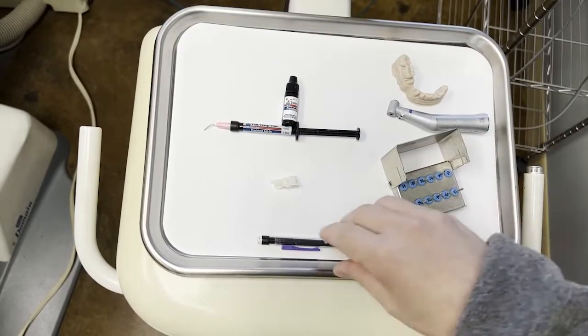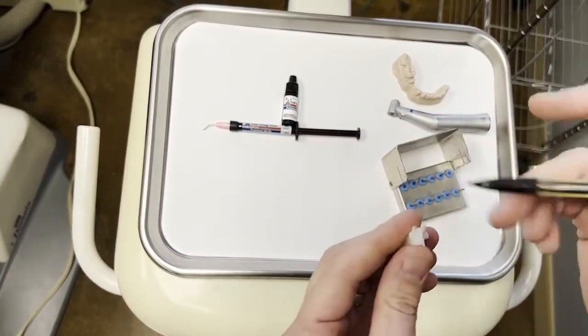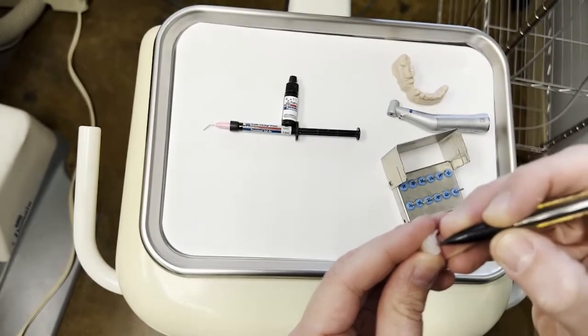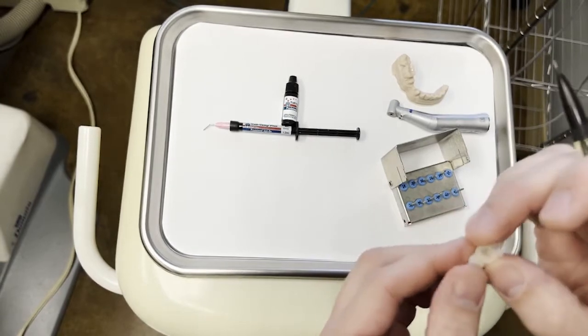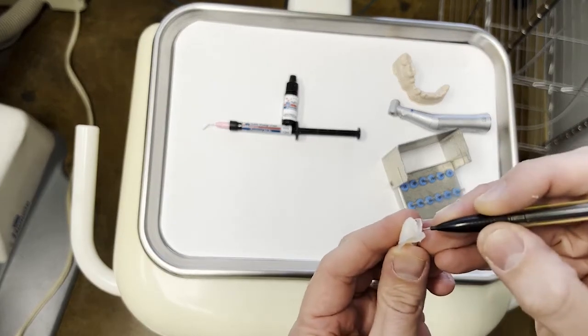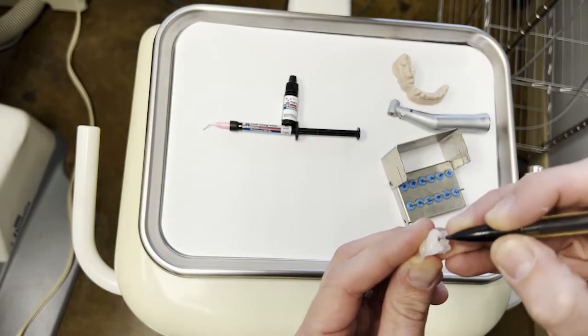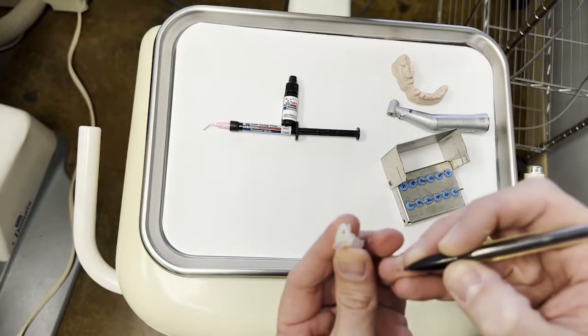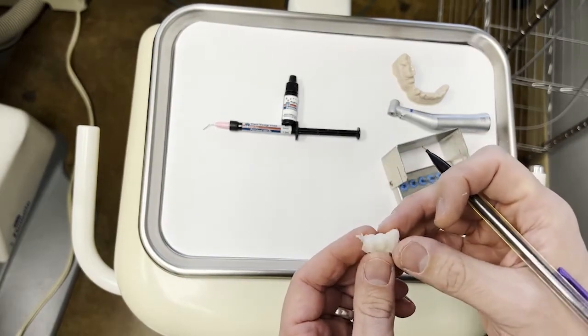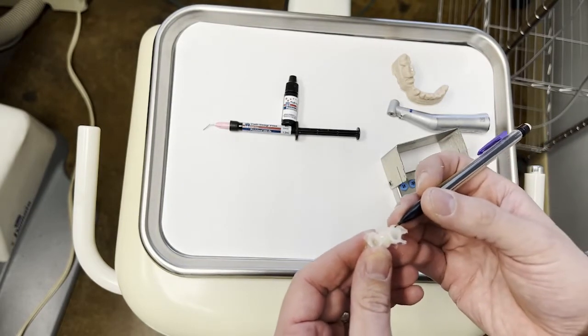Now that we have our provisional made, it's time to trim it. And one thing that I do always on multi-unit restorations, and even a lot of times on single unit restorations, is I will go in and take a pencil and mark the interproximal contacts. You can kind of see that on this material you get a real glossy finish right there where it touched the tooth in front. So I'm going to mark that to make sure that when I'm trimming this, I leave that pencil mark behind. If I leave that pencil mark behind while I'm trimming this, I know that I'll have interproximal contact on my provisional. So now the first thing I have to do is just start getting all of this flash out of the way. And this is a multi-unit FPD.